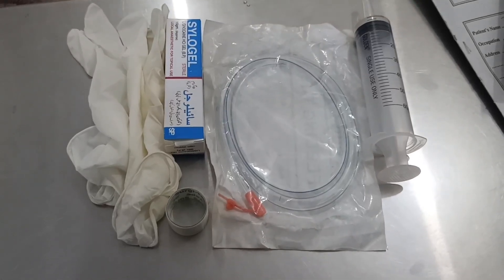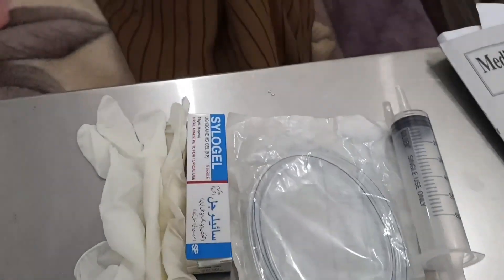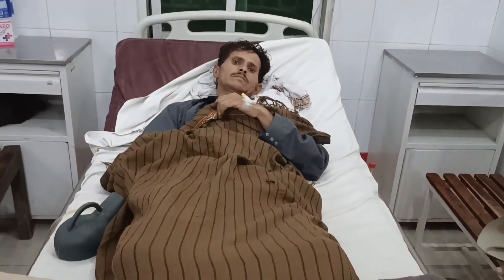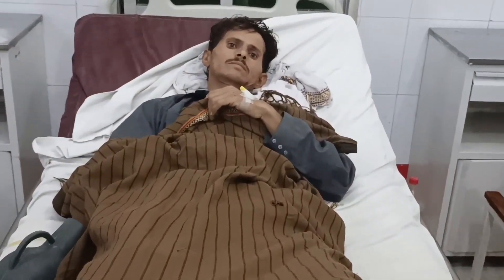As-salamu alaykum everyone, I hope a lot of you are doing well. In this video, I am going to talk about how to pass the nasogastric tube (angiotube) to the patient.